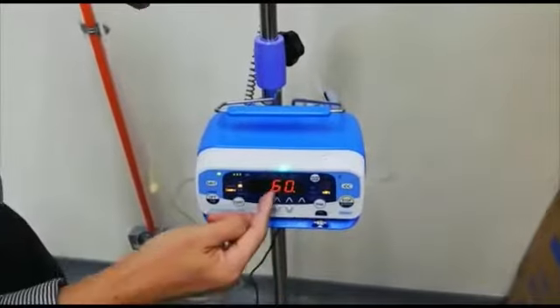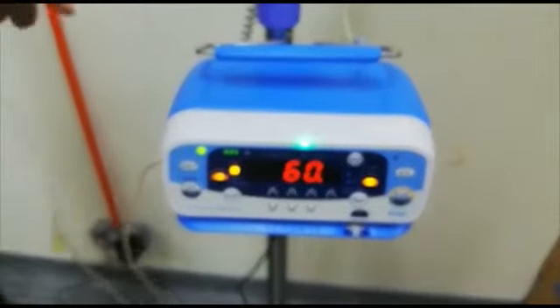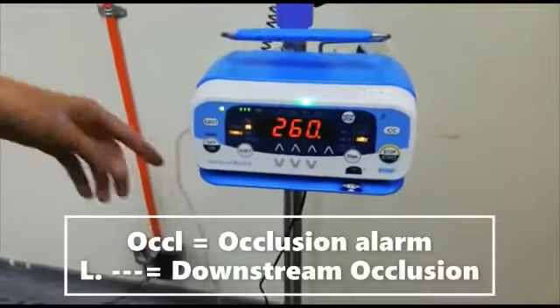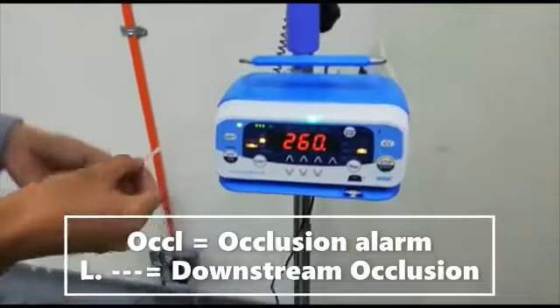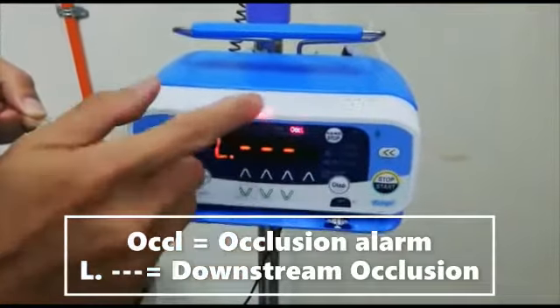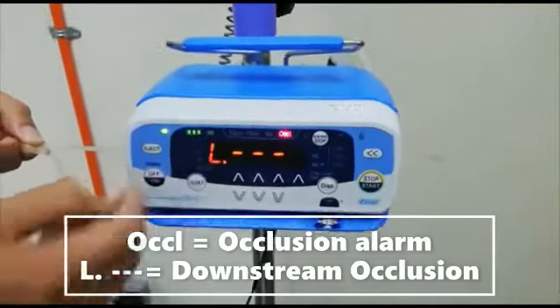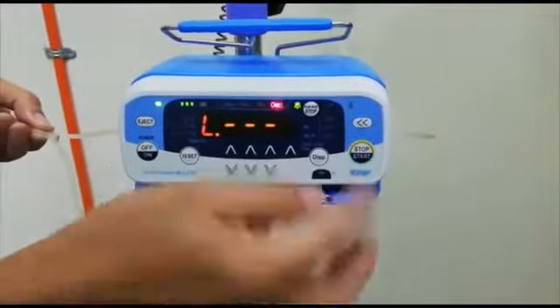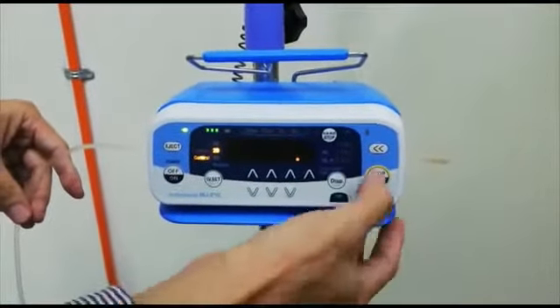Start. Now the green light indicates the solution is running. You can see here, the solution is running. First, I'll show you downstream occlusion. This one is to the patient. If there's any occlusion over here, you can see it shows OCCL. Then the alarm sounds and there's also a red light here. The lower indication means downstream alarm. What you do is you have to silence it first. There's an indication here. Then you rectify the problem. You press one more time. Then you can restart.